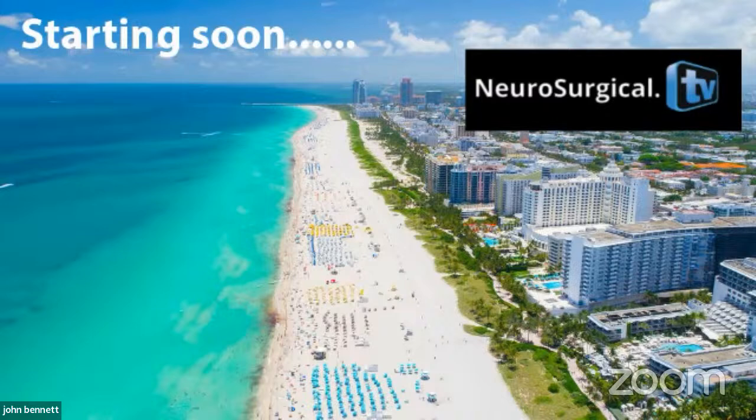And then once we finish the petrosectomy, we'll open the dura and expose the subtemporal component of the tumor. This tumor will be readily removed through your traditional debulking and then extracapsular dissection. And then we have to think about accessing the posterior fossa by dividing the tentorium.